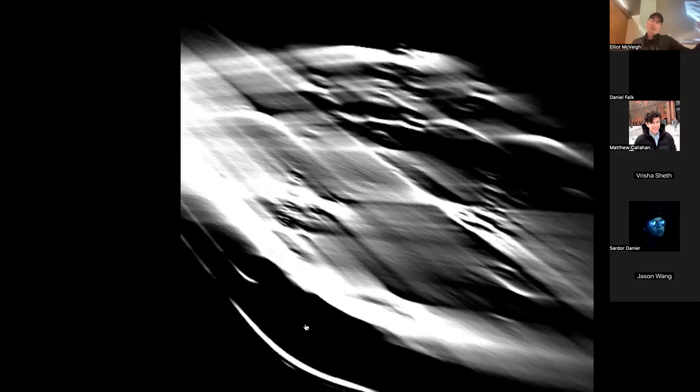What does it give us? When we project that back, you can see that we have a really good idea of where this edge is. We have a good idea of, say, this edge right here, right? So it's giving us a lot of information about certain edges in this object. However, if I ask, where is an edge, if I was to draw an arc and find an edge over here, I have no information at this point about where they are, because all I have thus far is added up the views that are at the angles sort of going across this way.